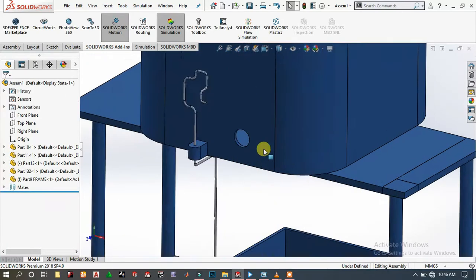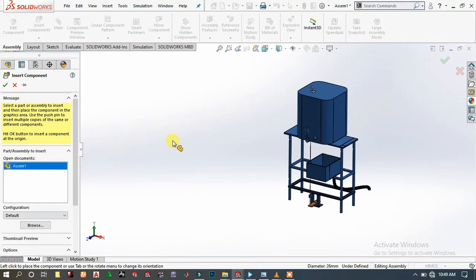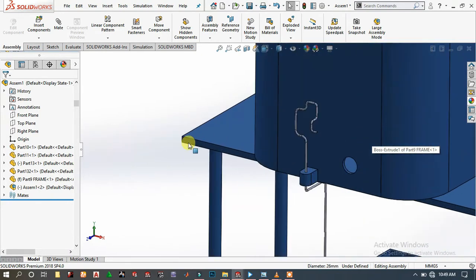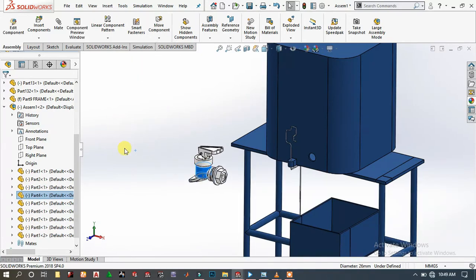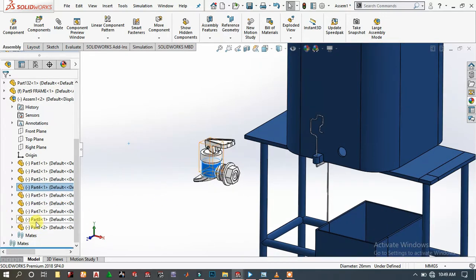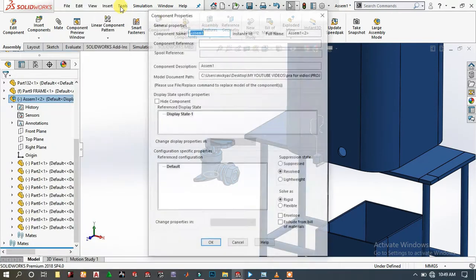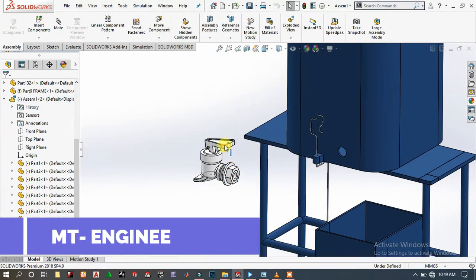Here we have to add the tap. Go to insert components, choose the tap and place it here. Drag this around here. Then we have to make it flexible. So right click, component properties and make it flexible. Now it is flexible.